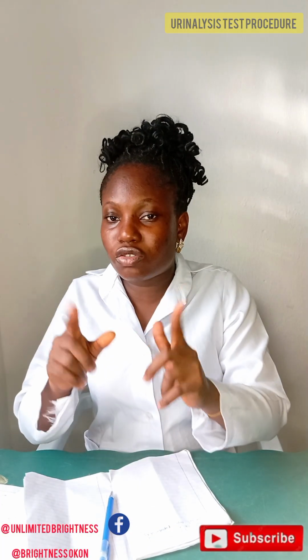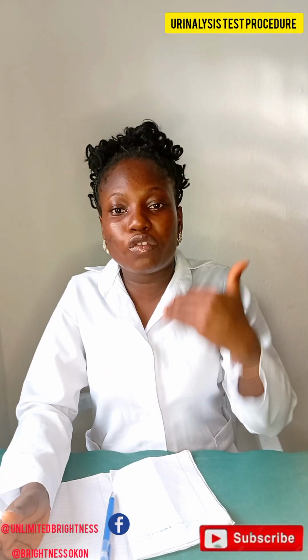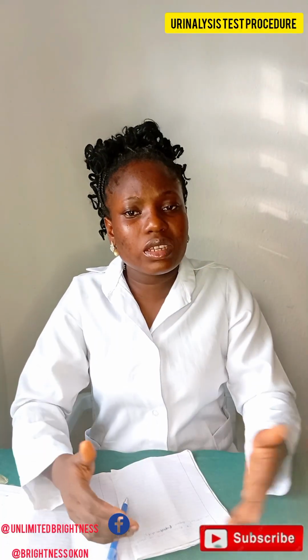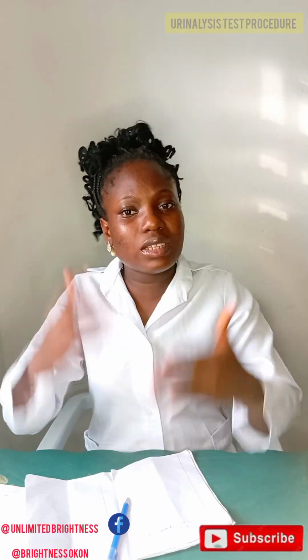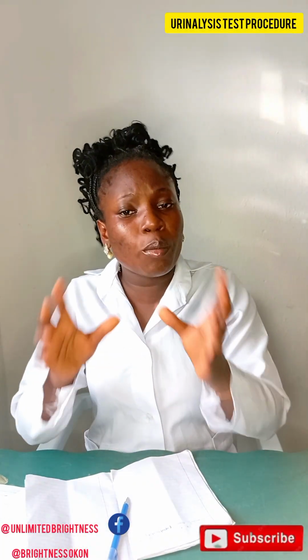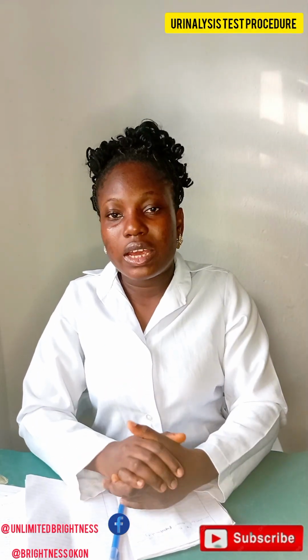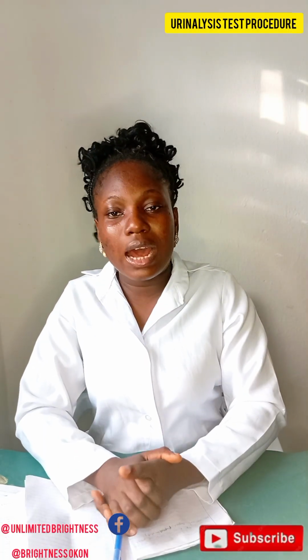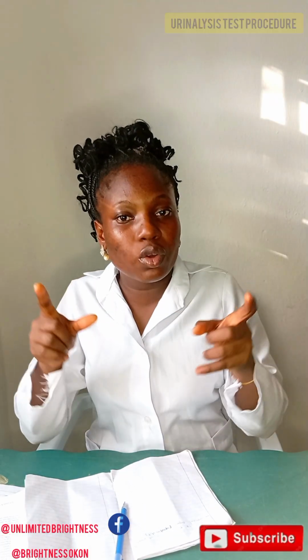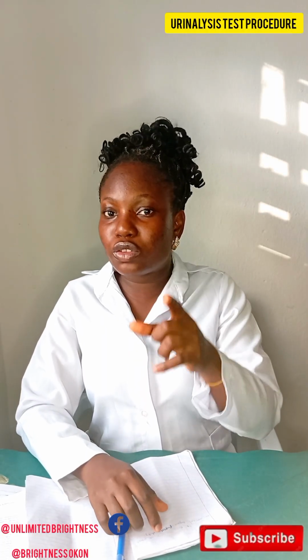It has gotten to its renal threshold, such that there is so much in the blood that it's spilling into the urine, which is a function of your kidneys not doing what they're supposed to do, or your pancreas not regulating the insulin and the glucose hormones that take care of glucose metabolism. If these things are not properly taken care of, it is also a call for alarm. And this particular test, called the urine analysis test, helps us have a clue of what is going on inside of you. So I wish you can stick with it as we go into the procedure for carrying out this test.